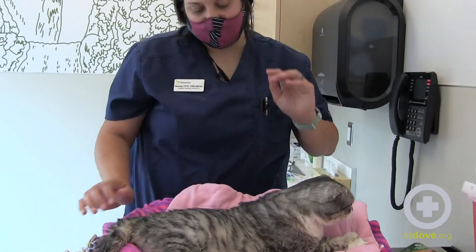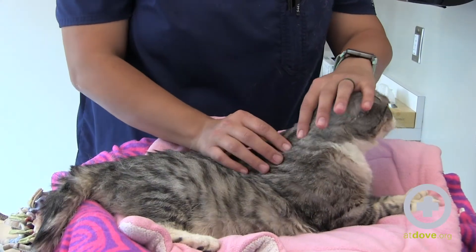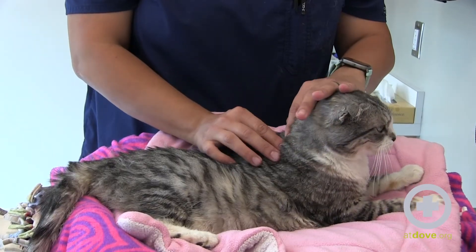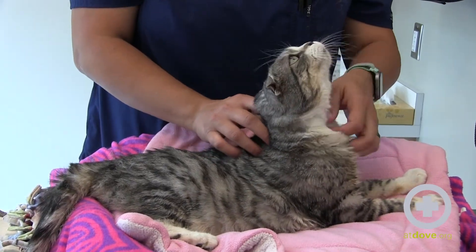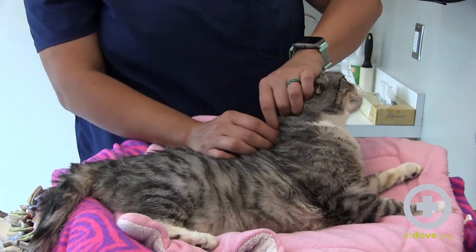The best place to give insulin injections is over their shoulder blades. She's a pretty round girl, but if I really feel, I can feel her shoulder blades here, and I can pinch her skin to make a little tent.